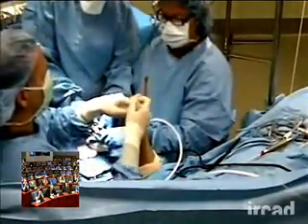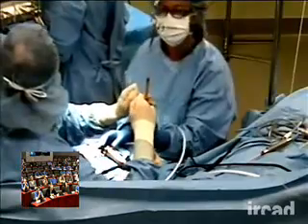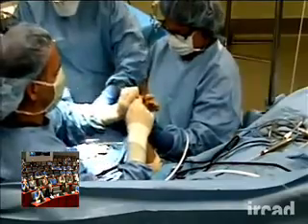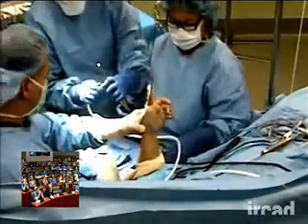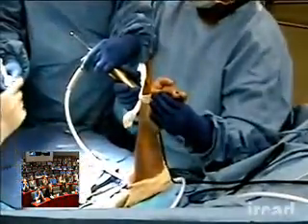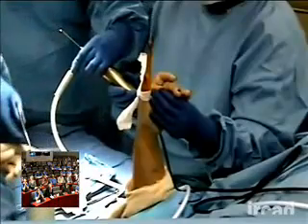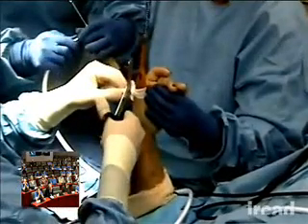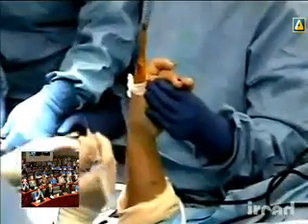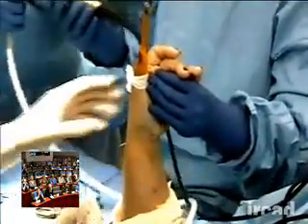Oh, great. Perhaps our first technical problem. Cannot see the x-ray. Okay. The signal will not go through the polycom, but okay. Zoom into the hand here, please. Externally. I need scissors, please. This is medication for the thumb? She has a wrist block and sedation. Zoom in. I need somebody, Rosie, stationed over here who knows how to run this.